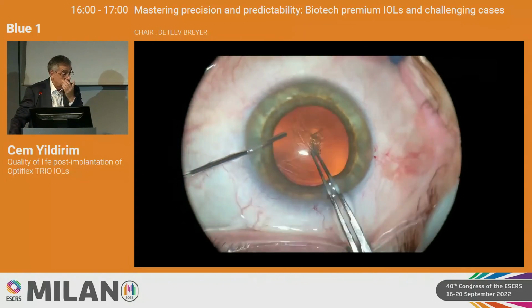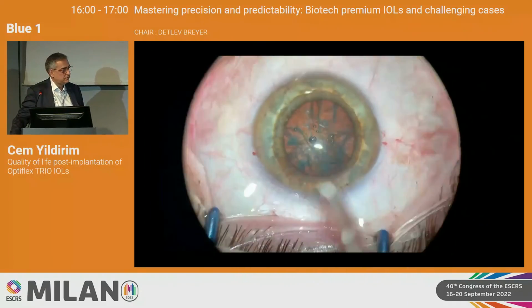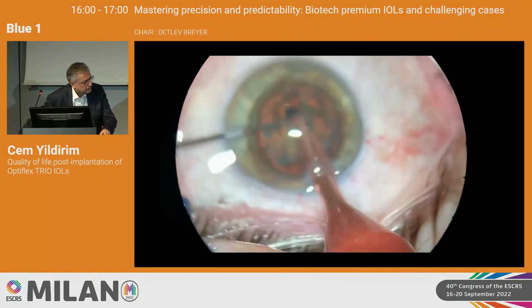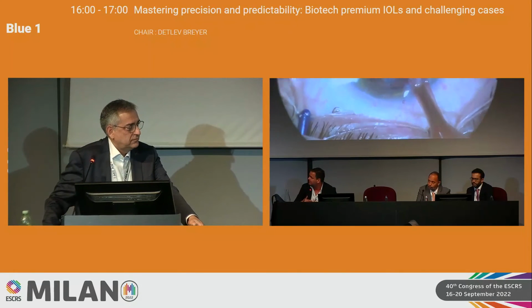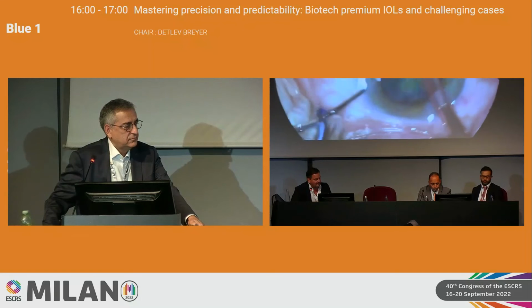So while the video is running, thank you very much for the nice presentation. I personally do like it as well because it has fewer rings at the outer side, and what you saw is that patients don't have so many photic phenomena in comparison to other multifocals. I think that's a very good argument.